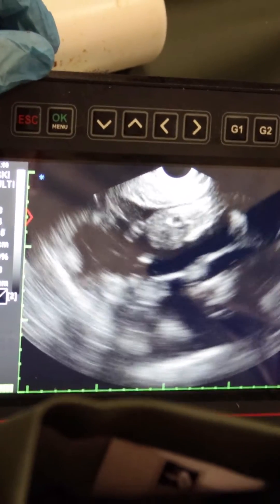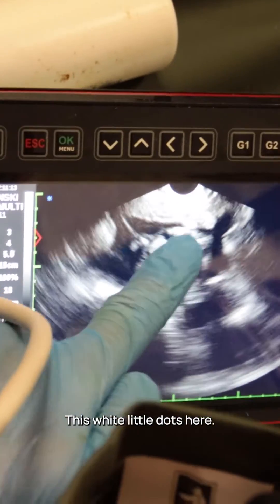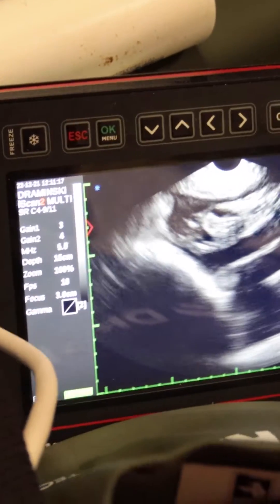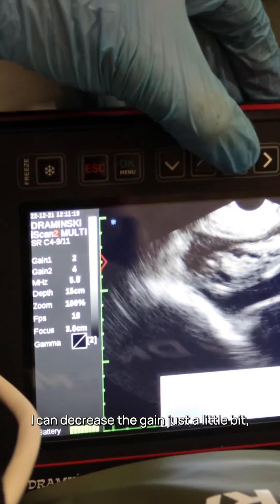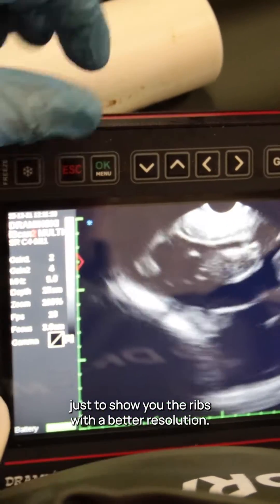Here we can see the fetus, and here we can see the ribs — these white little dots here. I can decrease the grain a little bit just to show you the ribs with better resolution.